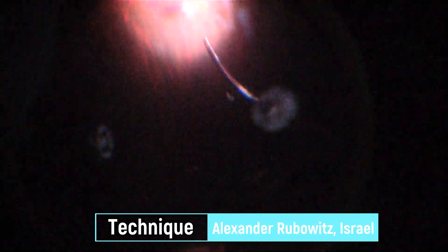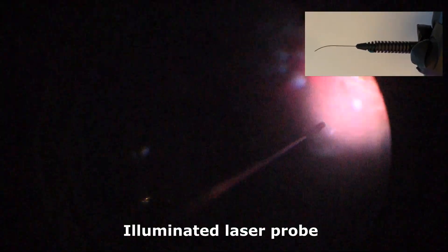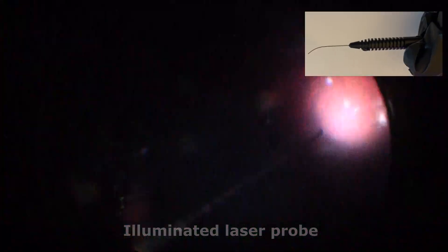The illuminated laser probe is the last technique I wanted to mention while talking about non-assisted scleral depression. It allows you to simultaneously laser in the far periphery, holding the probe with one hand and performing scleral indentation with the other. The disadvantage is a small field of illumination.